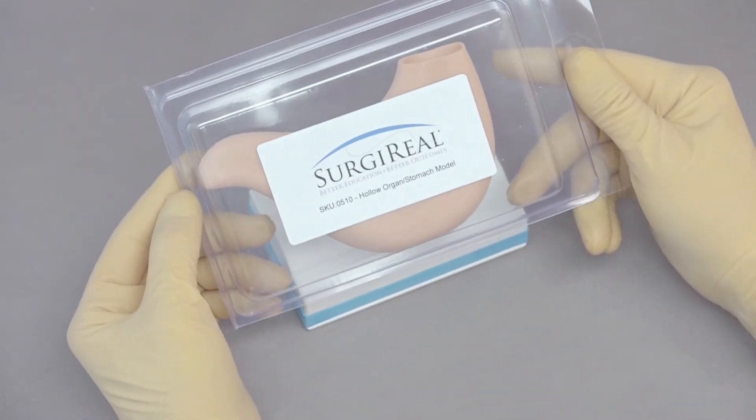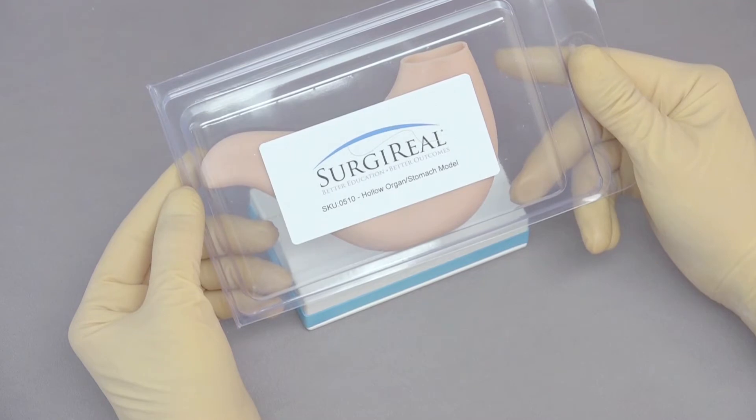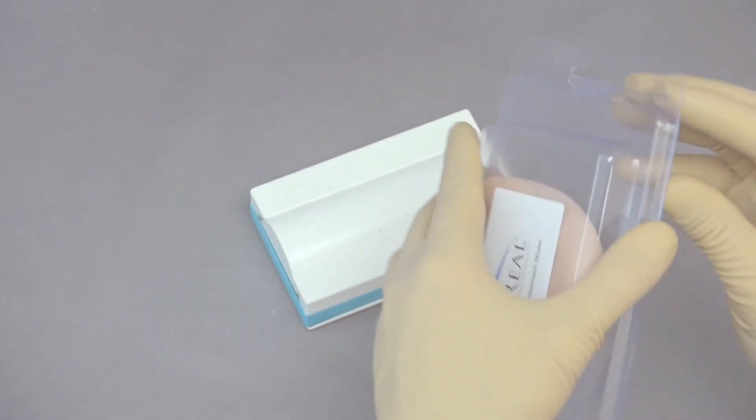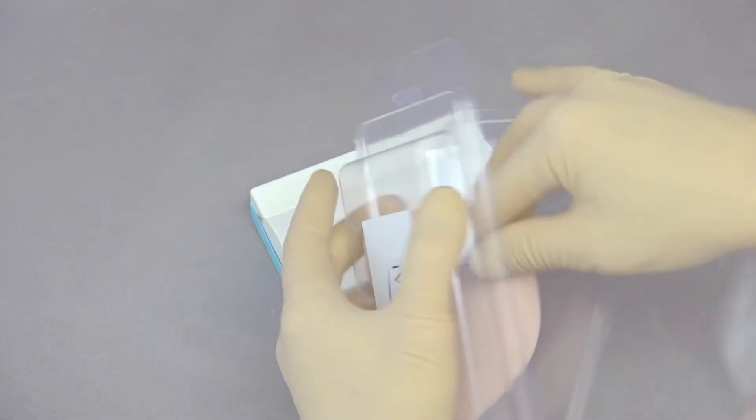We're going to suture the SurgiReal hollow organ stomach model. This represents the stomach of probably a medium to small breed dog.